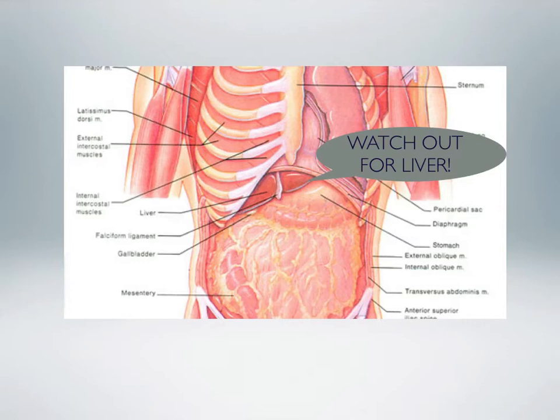But the bleeding issue is the big one in the U.S. If I had somebody in DIC, or somebody who was on Coumadin and you were afraid they bled into their heart, someone who has a bleeding diathesis, I would probably go parasternal. But the information on that, in my opinion, is purely anecdotal. I don't know of any major reports showing complications by going through the liver.